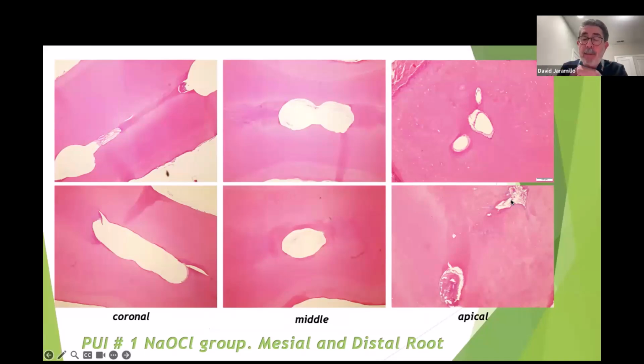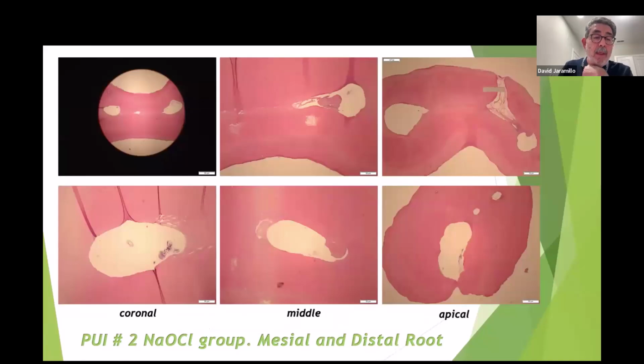In that multiple foramens, we have the presence of pulp tissue. Hard to clean. This is another case of ultrasonic irrigation. Still a bunch of some areas of pulp tissue remnants here in this lateral canal, obviously. Here the distal root, the main foramen, and two accessory foramen. This is not pulp tissue. That's an artifact.